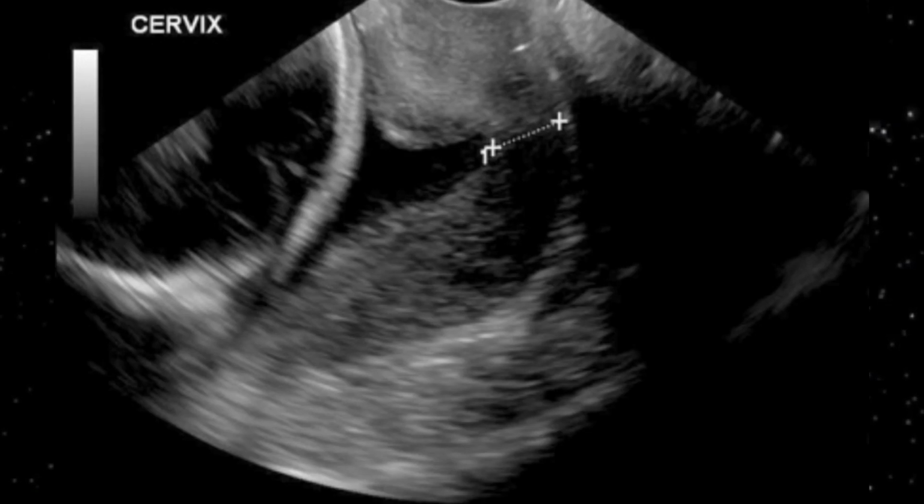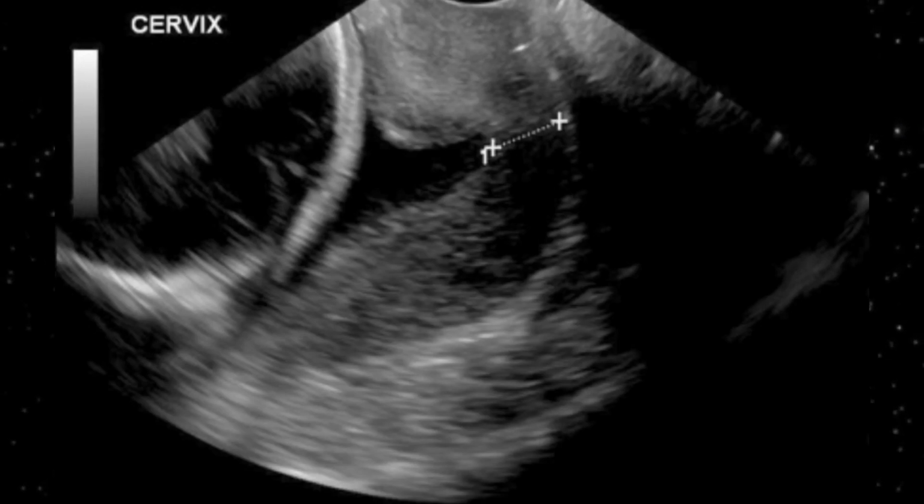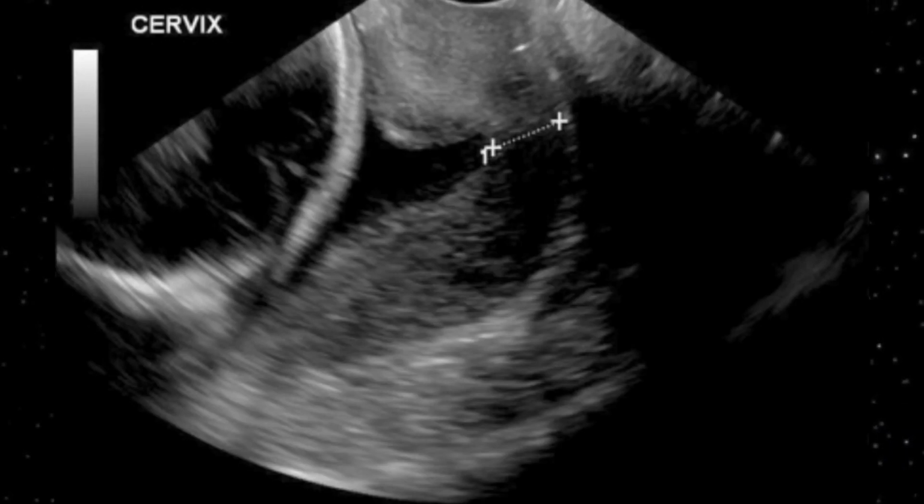This is another classical example of cervical incompetence. Here towards the left, you can appreciate the fetal head, which is clearly visible. Just adjacent to the fetal head, there are 3 important radiological findings you can pick. Number 1, the internal os is markedly dilated. Number 2, fluid is gravitating towards the endocervical canal.